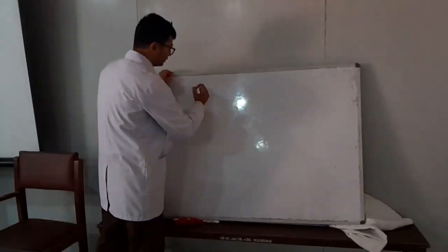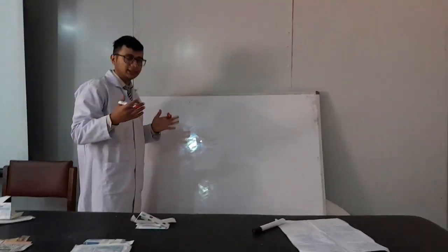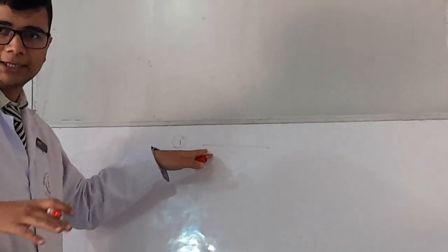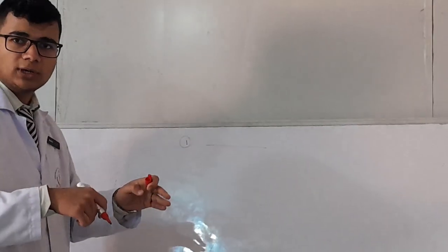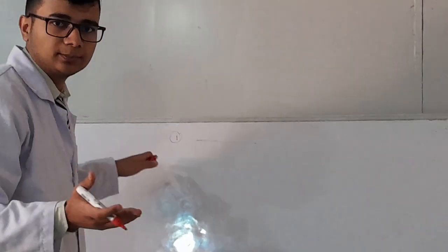The first type of suture needle is the straight suture needle. Like we have seen in our day-to-day practice while stitching our clothes or with a tailor, where they use a straight type of suture needle. It is used to suture the subcuticular plane, and one drawback of this type was that while navigating it, there were chances of needle prick injury. So this has been abandoned these days, but it can still be seen being used in some places.